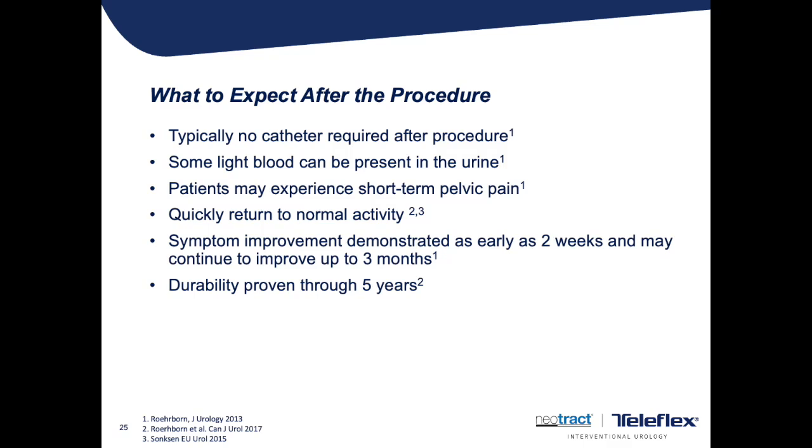And furthermore, it's a more durable procedure. There's actually new data that suggests the 5-year retreatment rate is about 13%, and we say 1 in 5, but I think with bigger numbers we see that improving. From a recovery standpoint, men tend to do better. Also, we have more experience with it, and it's becoming a more efficient process. And I think that's why we're seeing a more durable outcome.